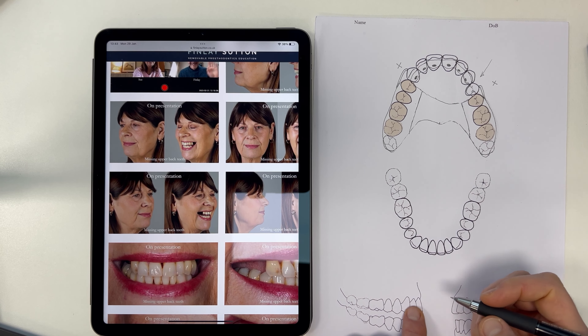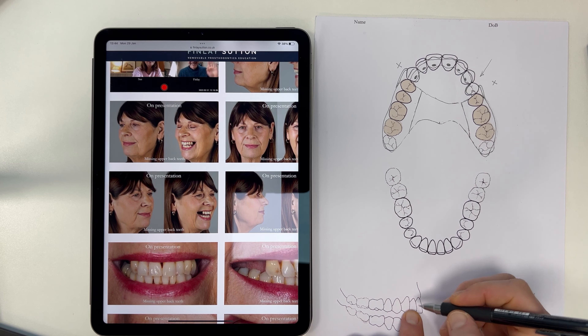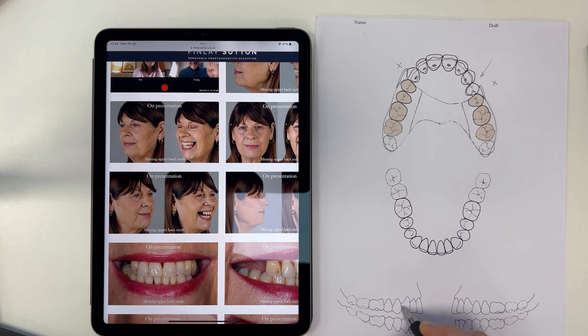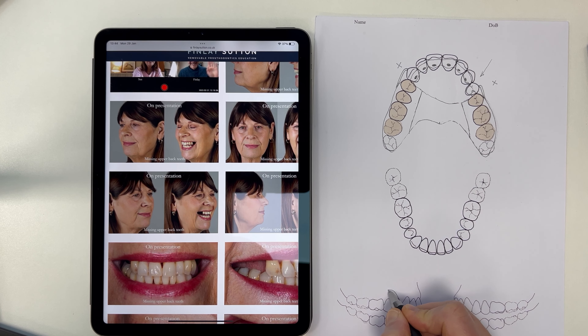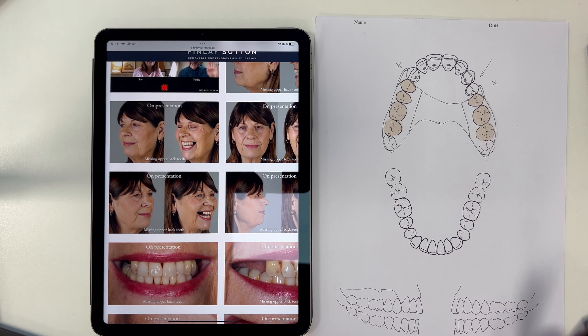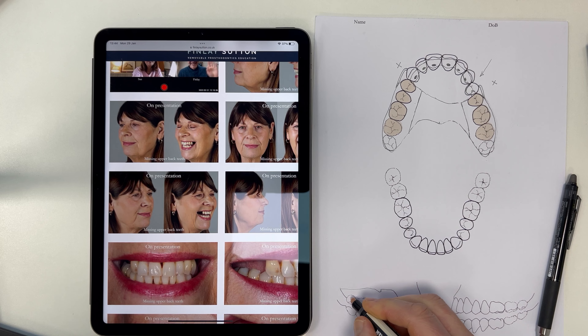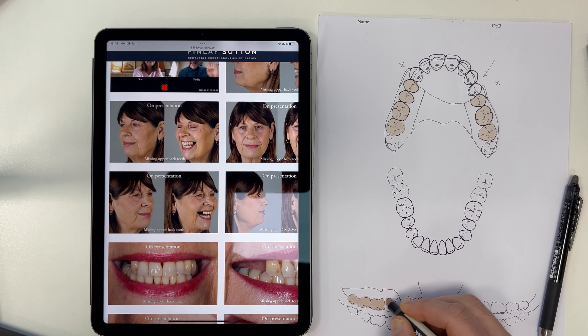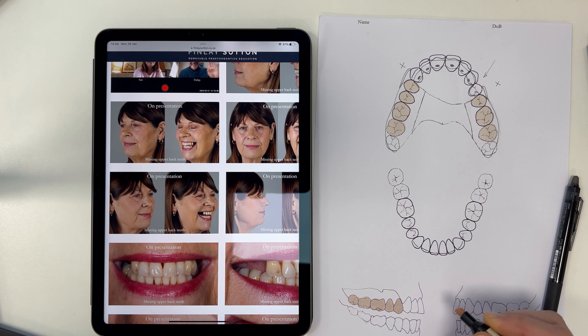Let's have a look at the side view here — I'm just going to call that in too. We've got right to the canine there, and then we've got the saddle area here. I generally just draw that, remembering that we've got the freedom there too. I'm going to call in those missing teeth just at the bottom there — just calling that in really nicely, that's great.